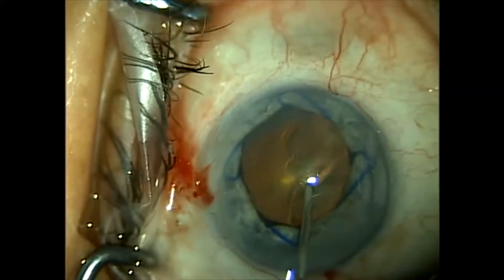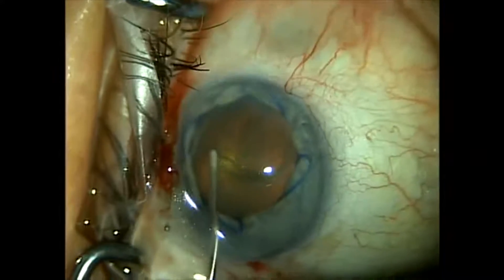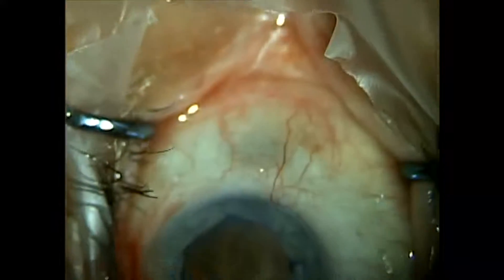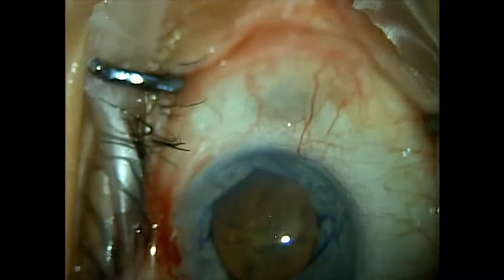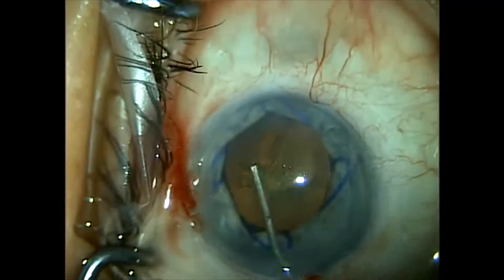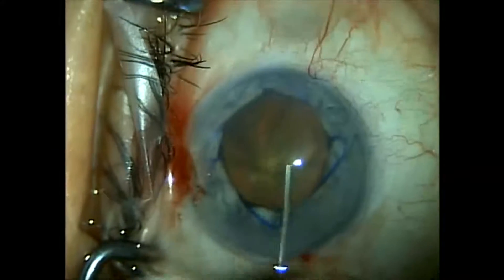The cystotome is attached to a syringe of Ocucoat, which is my preferred viscoelastic. Here we do the normal hydrodissection.